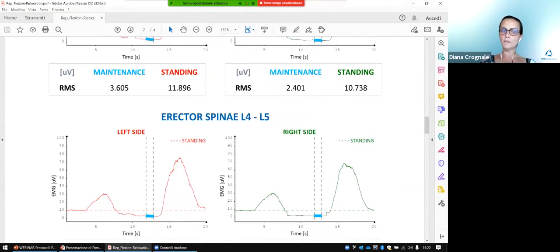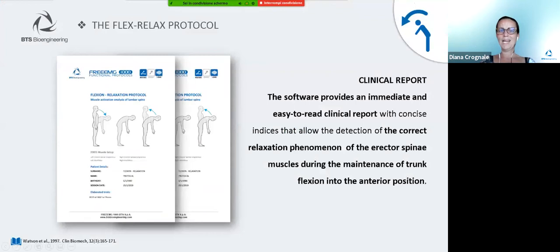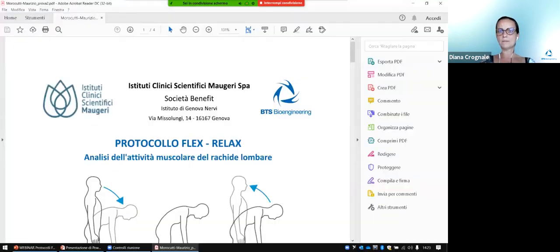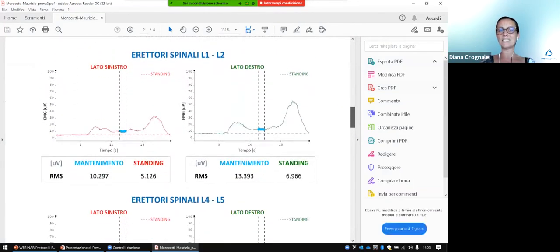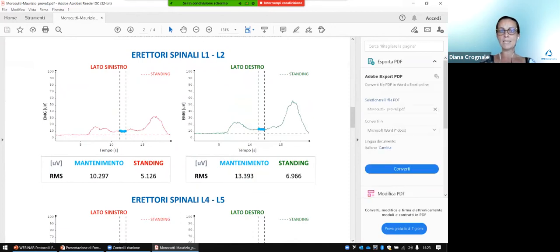In the table, you find also the numerical value in microvolts of the energy, so you can compare this value during the maintenance phase with the value in the standing phase. Now, let's look at how the pattern of the curve changes when the relaxation phenomenon does not occur. We can see immediately that the curve remains higher than the standing energy level.